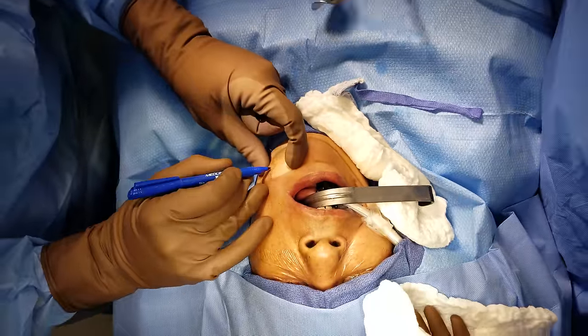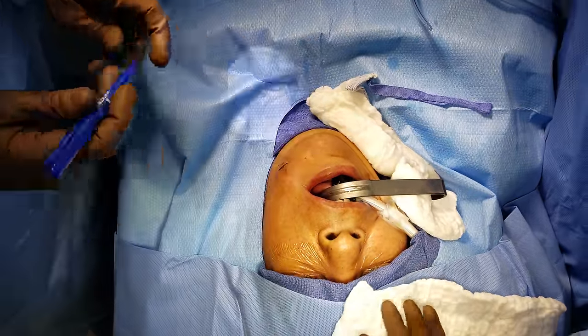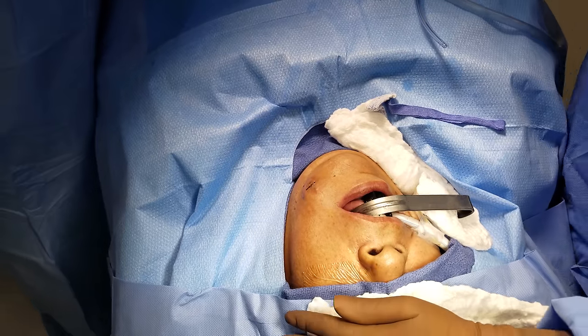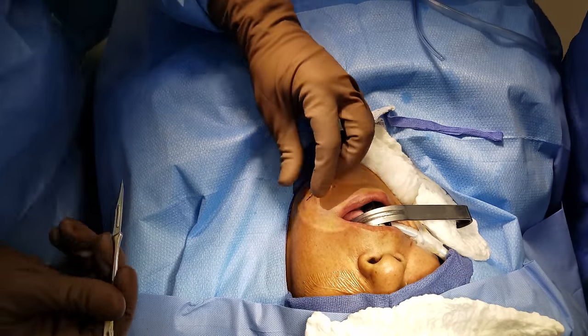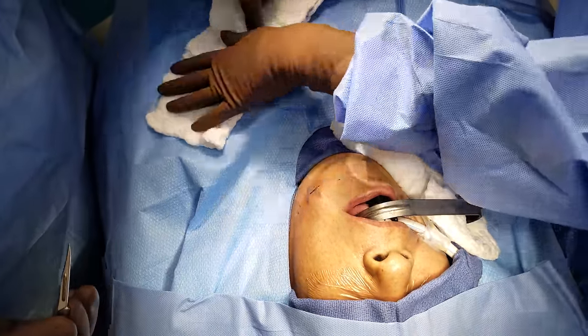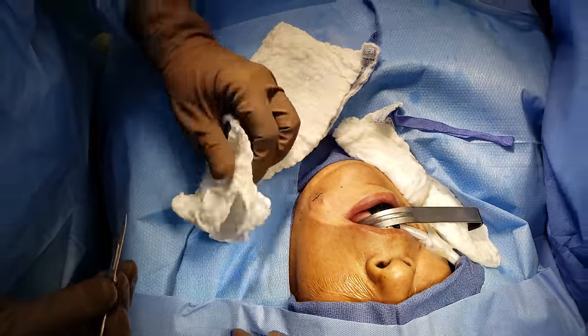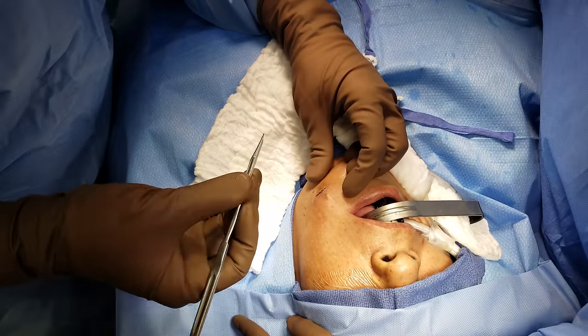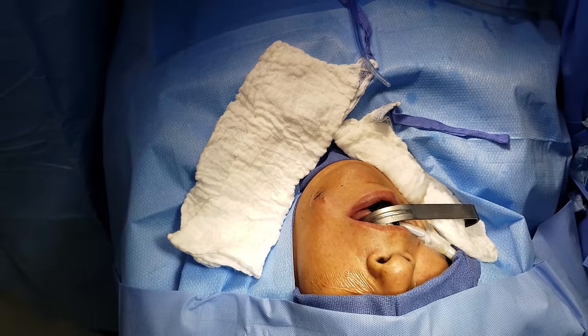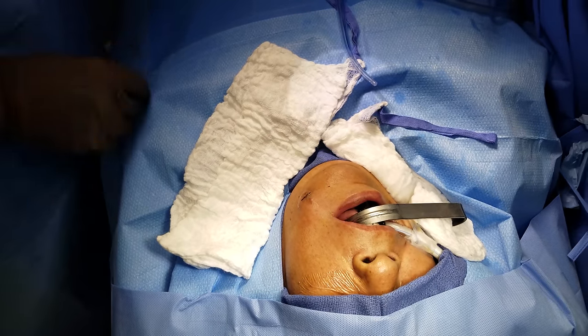Okay, here I'm drawing the incision that I'm going to make to drain the abscess. You'll remember from some of the other videos that one of the things we're trying to avoid right here is the marginal mandibular nerve, and that incision will safely avoid the nerve. Avoid the temptation to suck everything up.